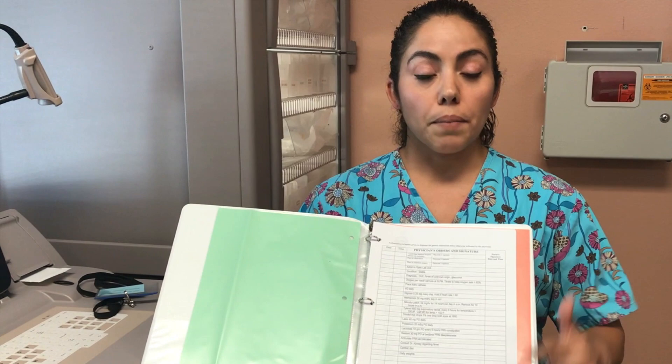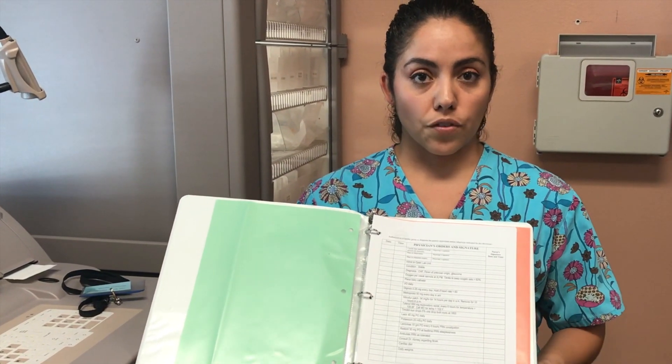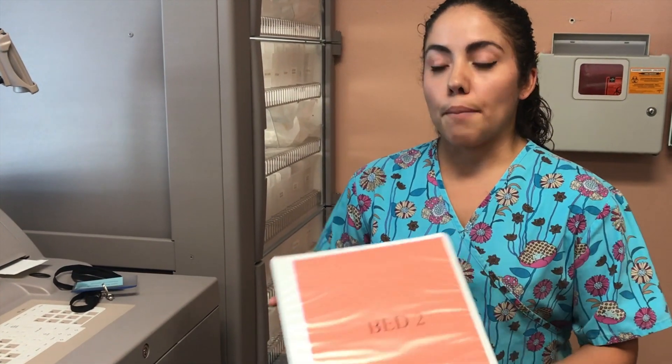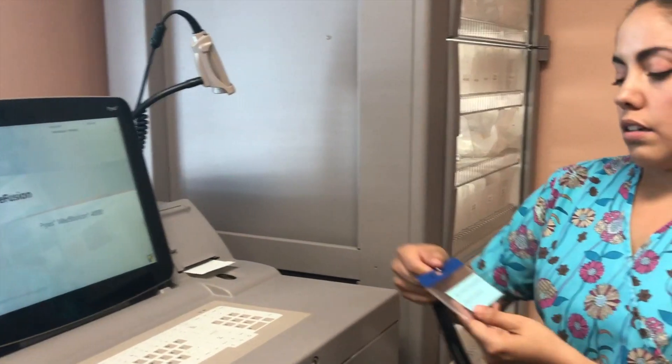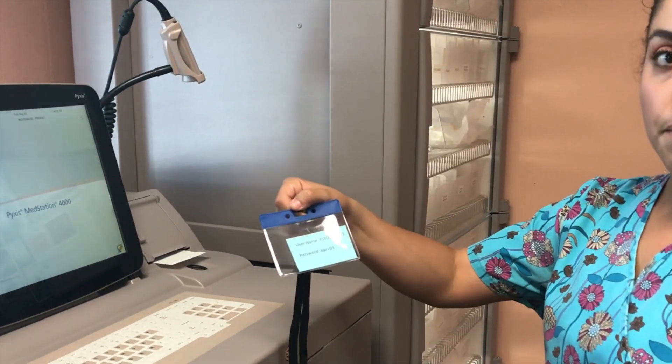In each scenario you will also be provided with a patient scenario. The scenario will include the patient's name and available medications for that patient. In this demonstration my patient is Michael Jackson. He is suffering from constipation as well as pain.